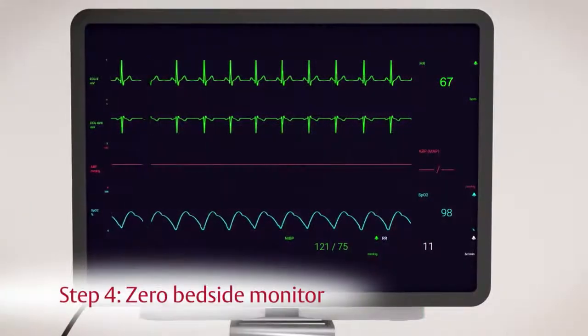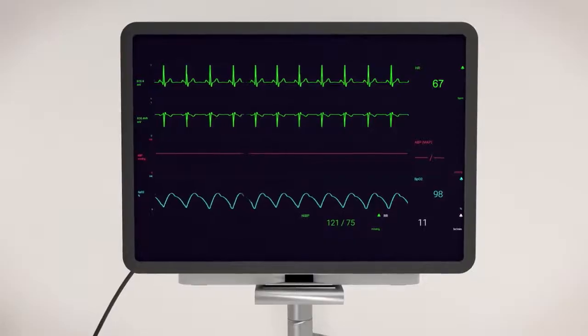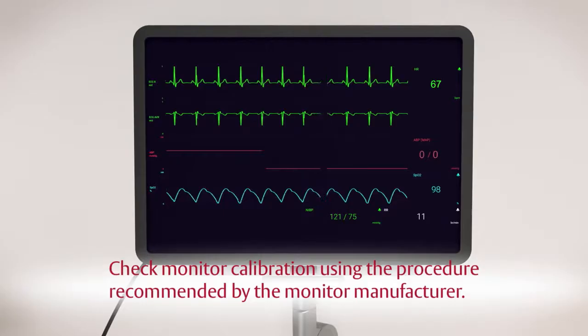Step 4. Select the zero function on the bedside monitor and confirm that the monitor's pressure channel waveform and numeric value display zero. Check monitor calibration using the procedure recommended by the monitor manufacturer.